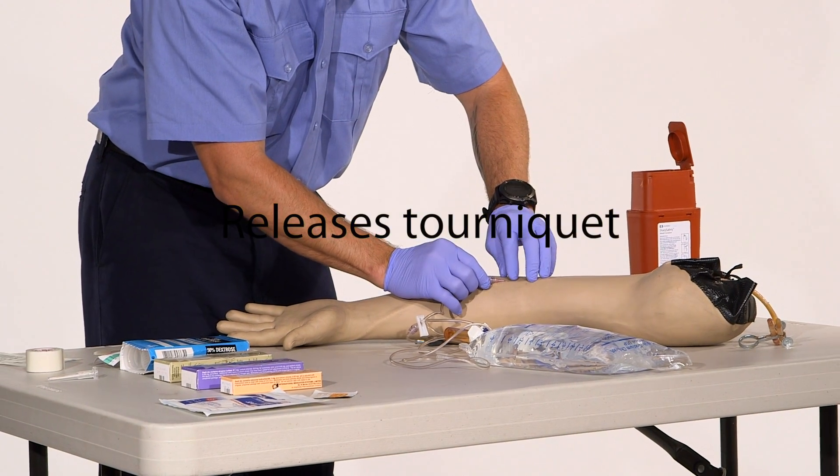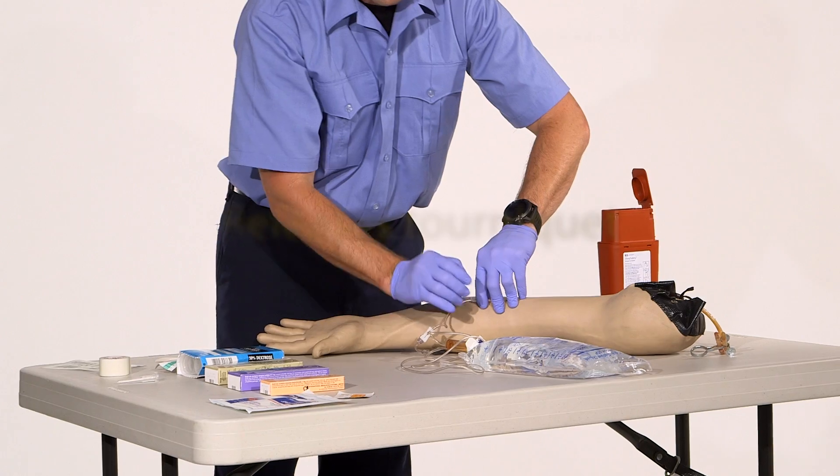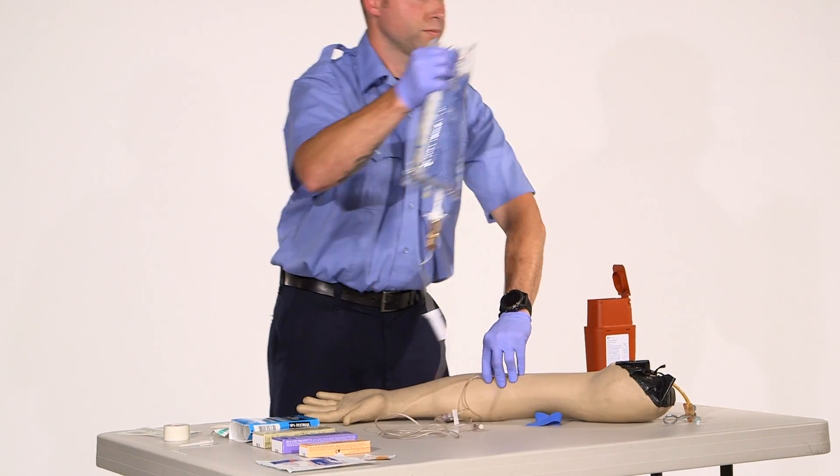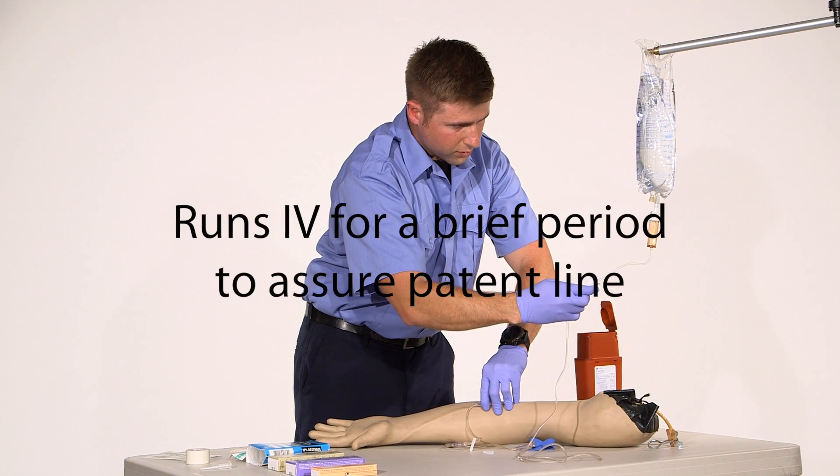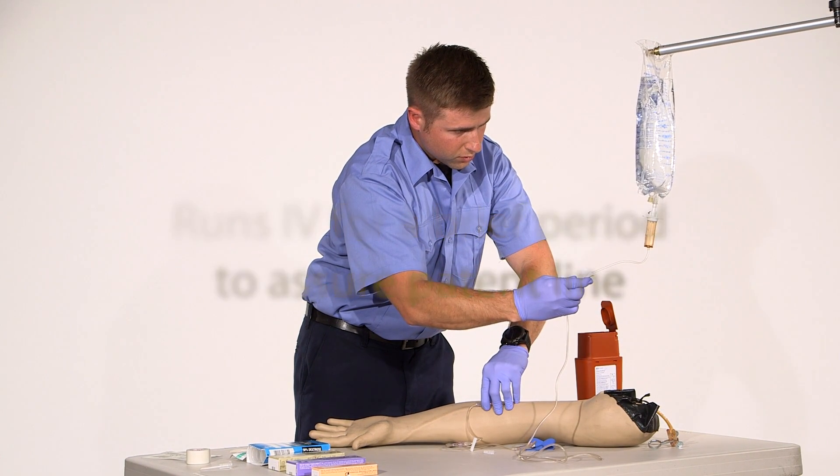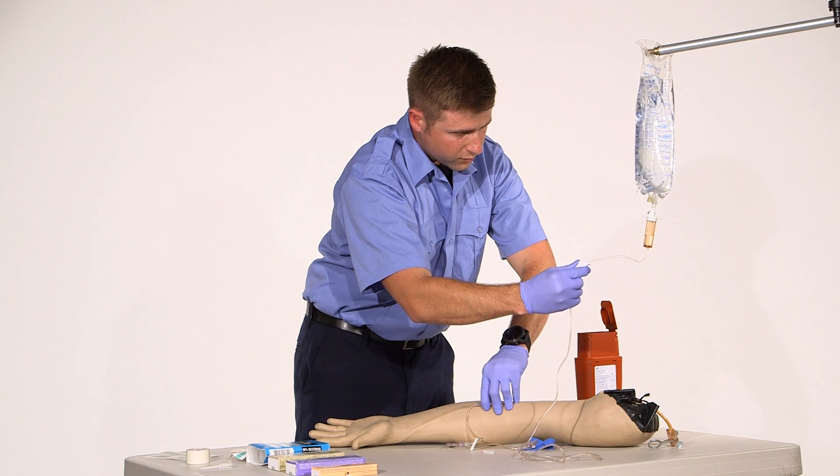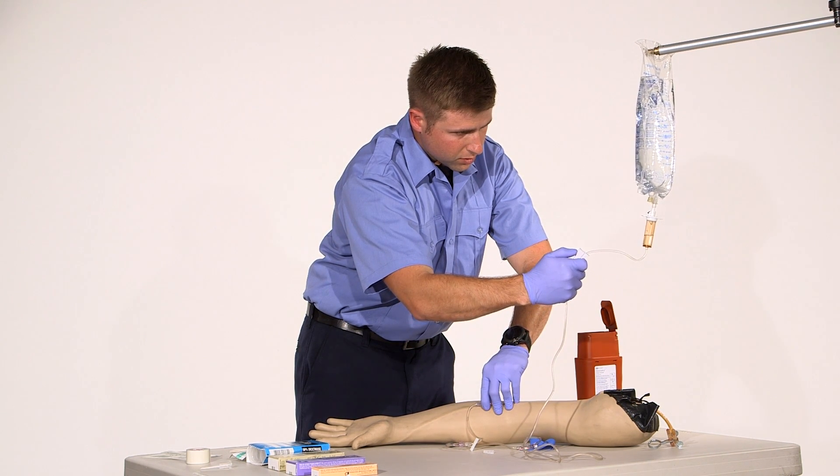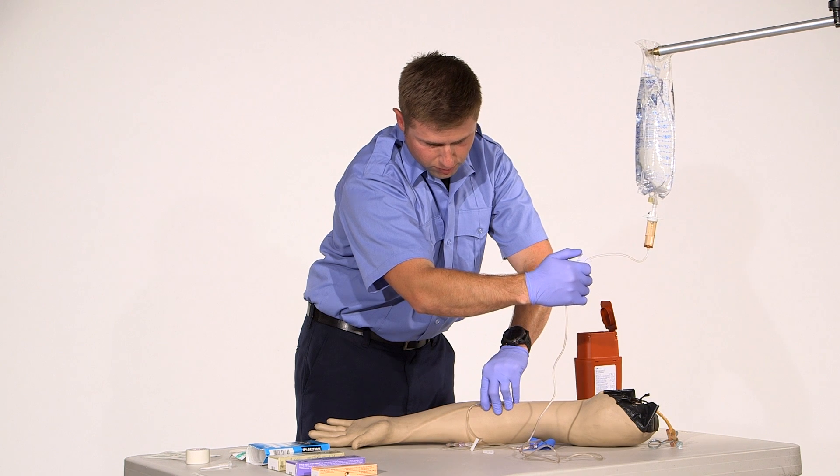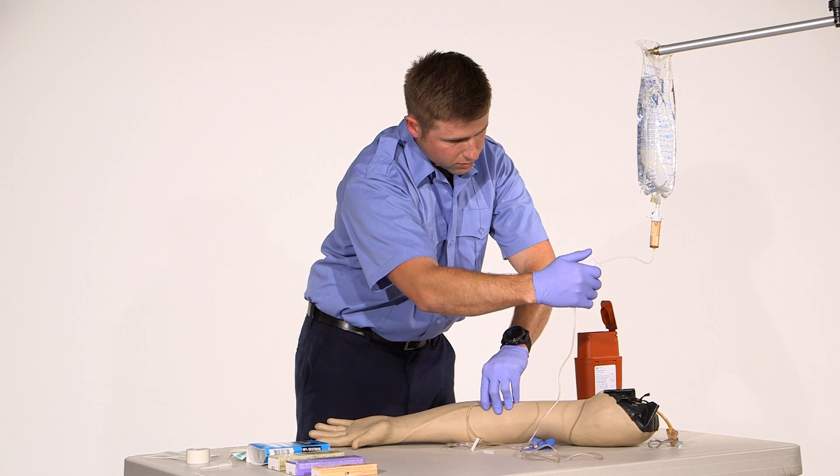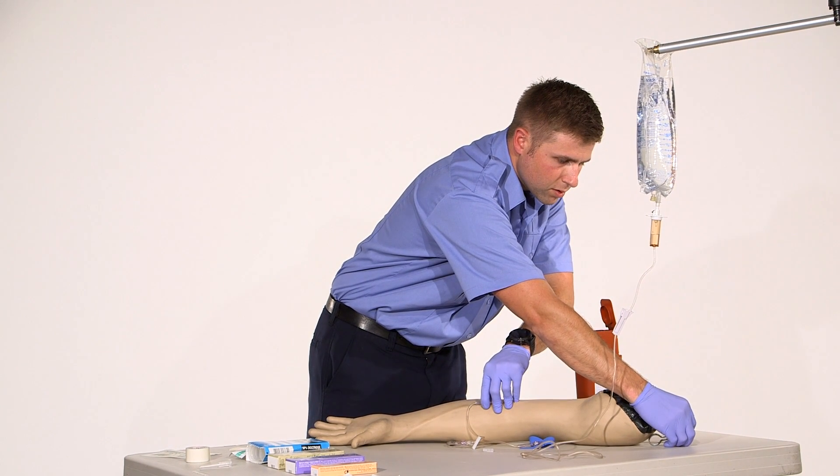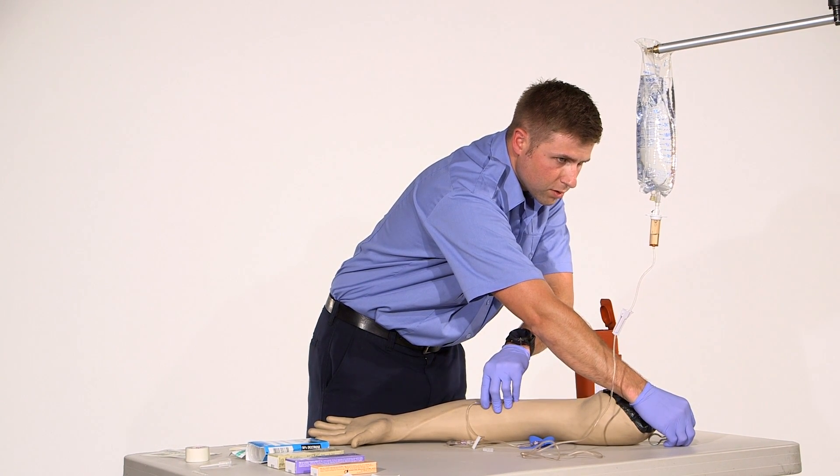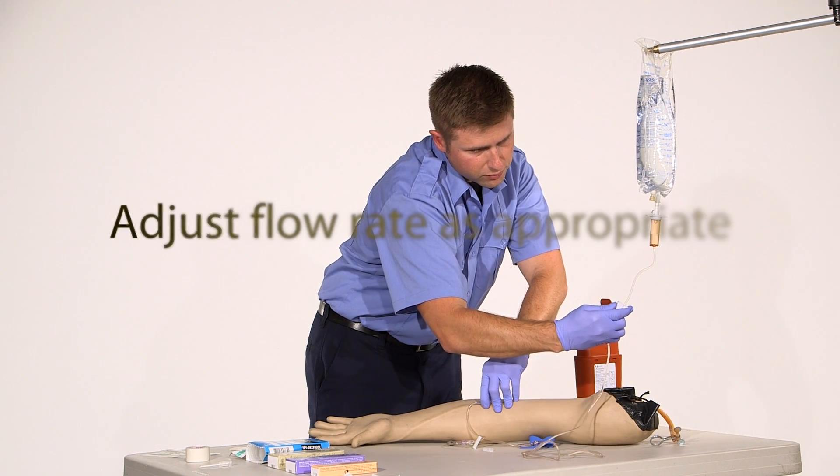Once that's on, remove the tourniquet, keep that secured, and place my drip set. I want to make sure that I'm going to flow just for a moment. Make sure I get proper flow. And bring it down to a TKO.